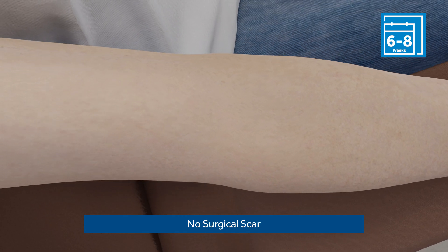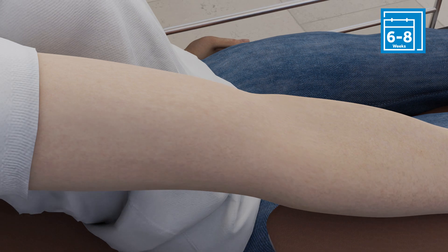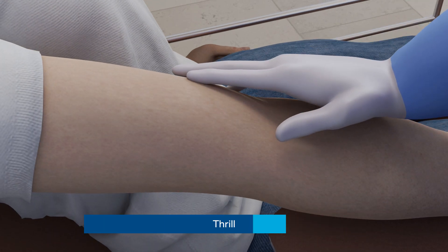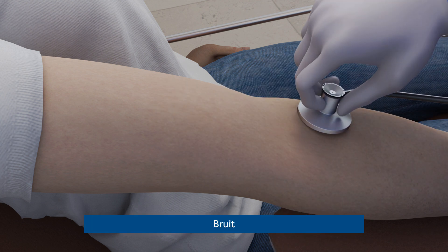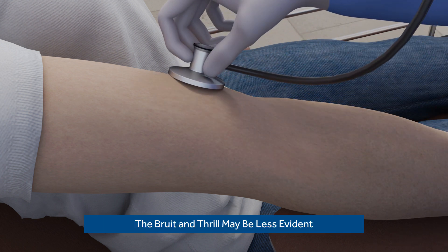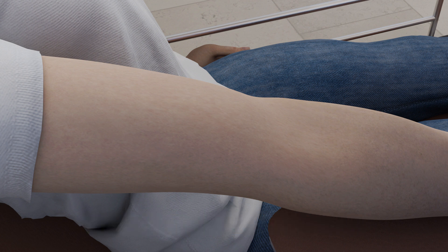Ellipsis AV fistulas do not require an incision, and therefore it is unlikely that a scar will be visible. While assessing the fistula, you can feel the thrill and hear the bruit just below the antecubital region, where it is the strongest, and at the distal upper arm along the basilic and cephalic outflow. Both may be less evident than that of some surgical fistulas. This does not mean that the fistula is not functioning.